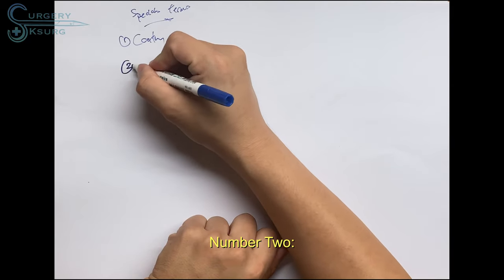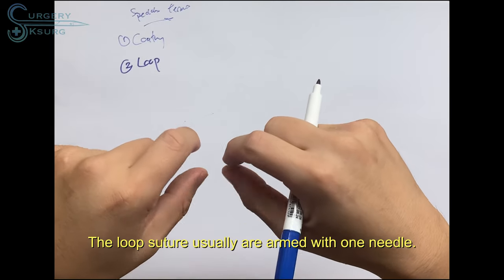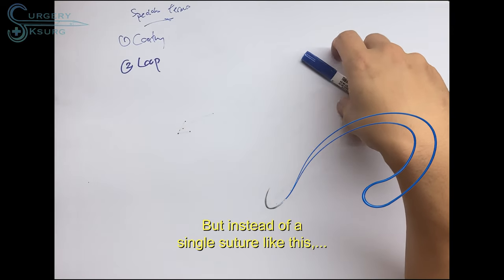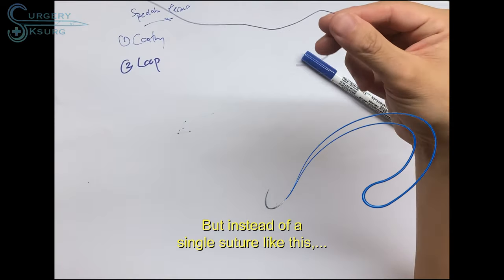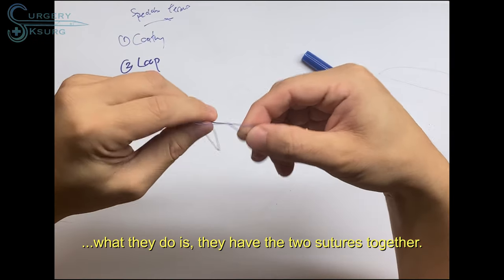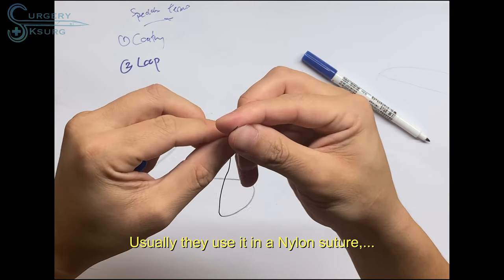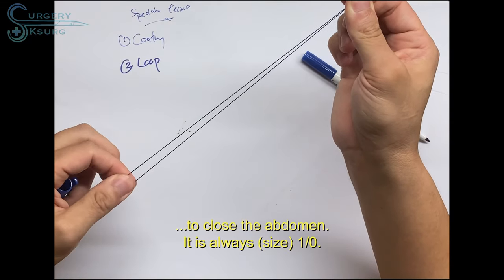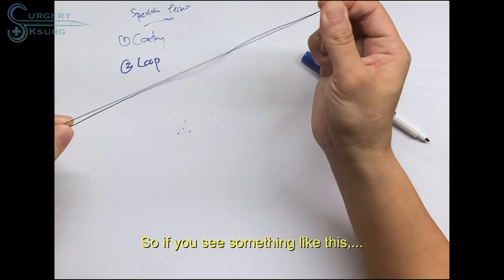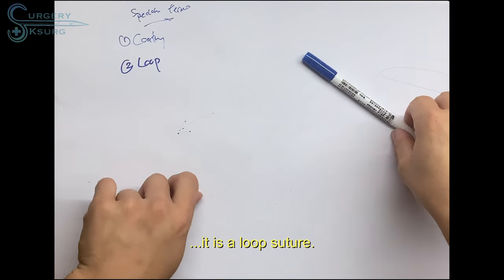Number two, you can also have a loop suture. The loop suture is usually armed with one needle, but instead of a single suture like this, they have two sutures together. Usually they use it as a nylon suture to close the abdomen. It's always 1-0, so it will be something like this. There is a loop suture.